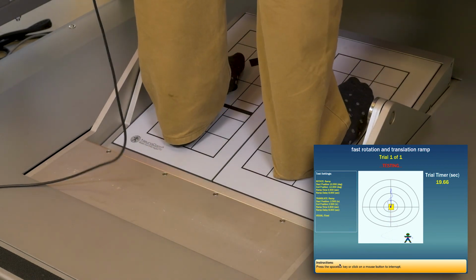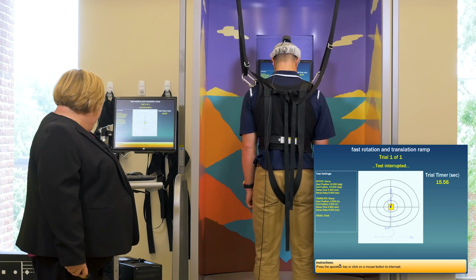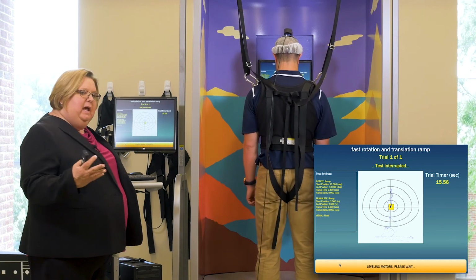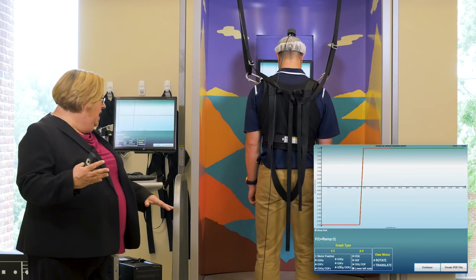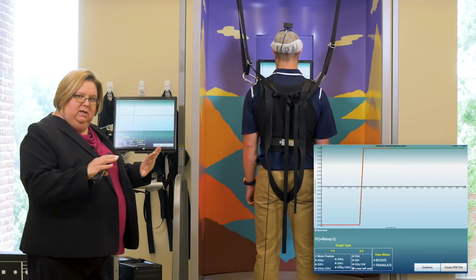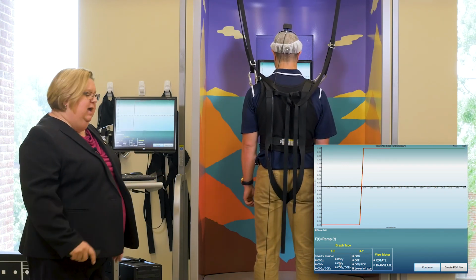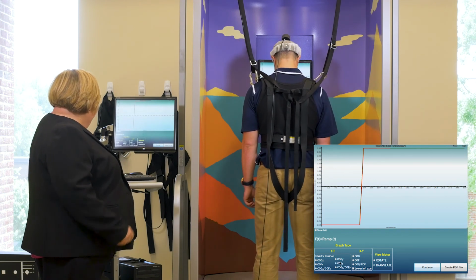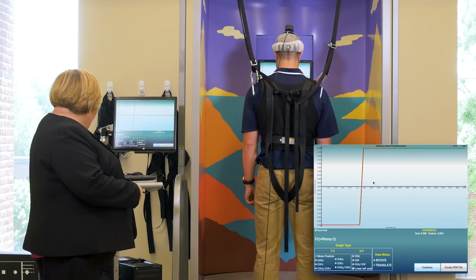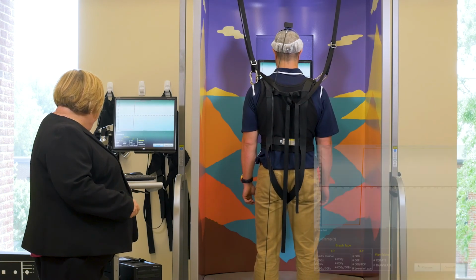And it actually made him step. Okay. And I'm going to stop it because he did step off, and for safety's sake, I want to make sure he's not where it moves, the corners where it's moving when I reset it. Okay, so he stepped back on. But you can see how abrupt that ramp rotation was.